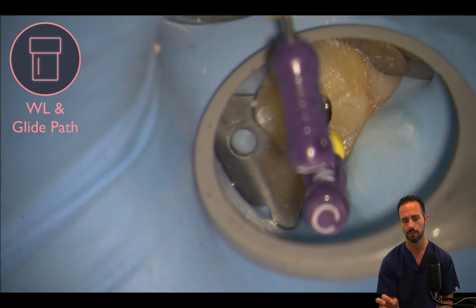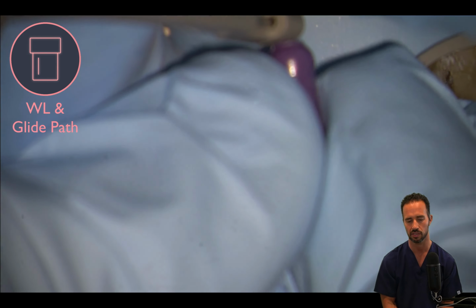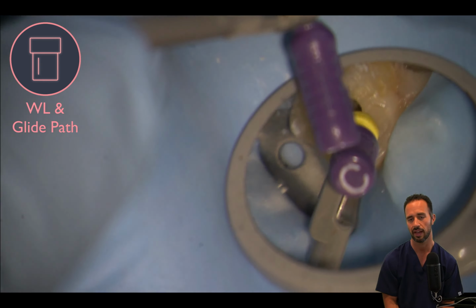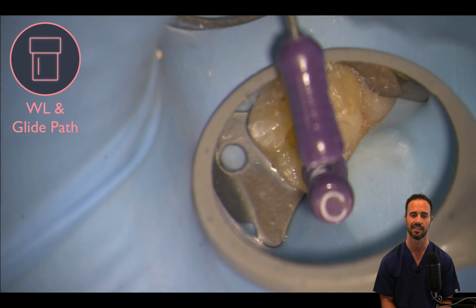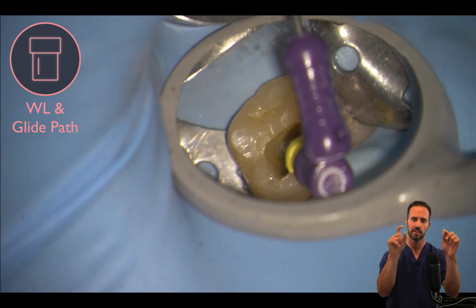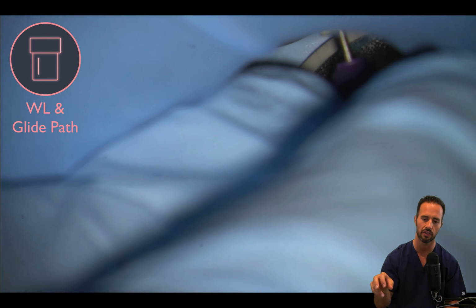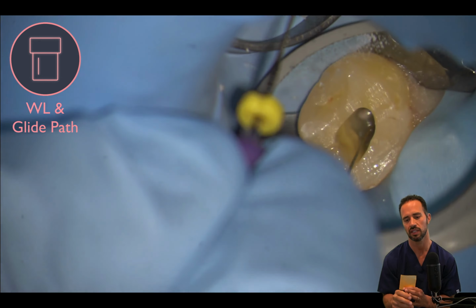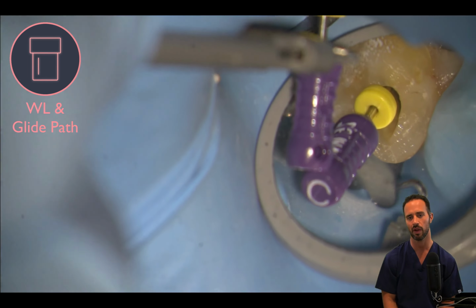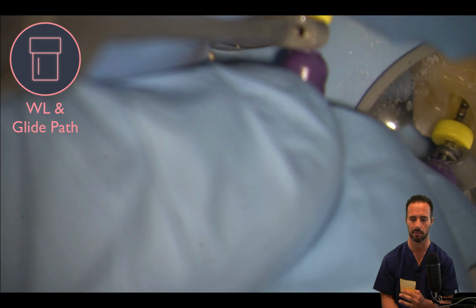So now we've taken that same 10 file and we've introduced it into the distal buccal canal, and we've got our apex locator clip on there, and we're determining in the distal buccal that our estimated working length is 19 millimeters, which is oftentimes the case. These roots are oftentimes symmetrical, and the distal buccal is usually a millimeter longer than the mesial buccal. Honestly, mostly due to the fact that the reference point is the mesial buccal, so it's a little further away from the reference point, but they're probably about the same length if you were to measure them, apples to apples.